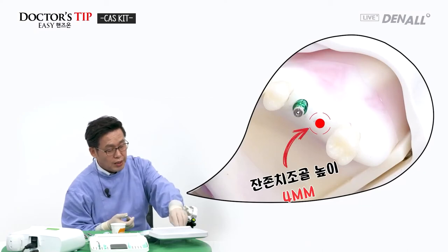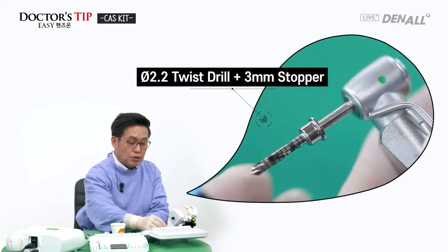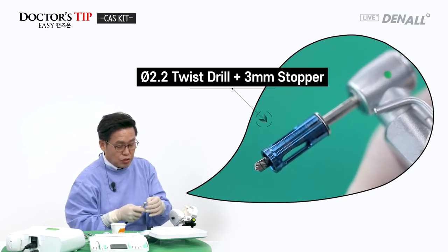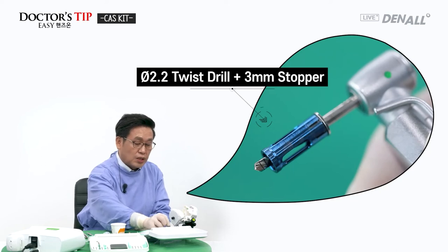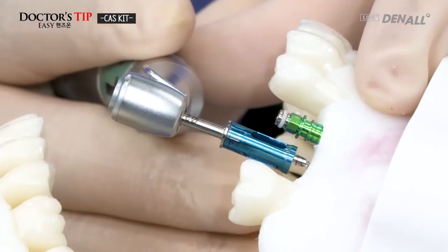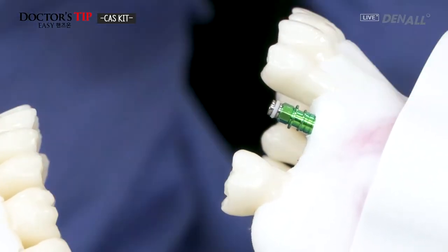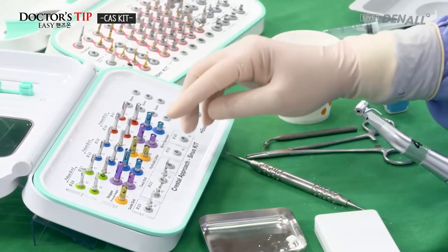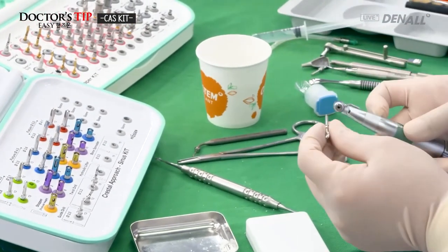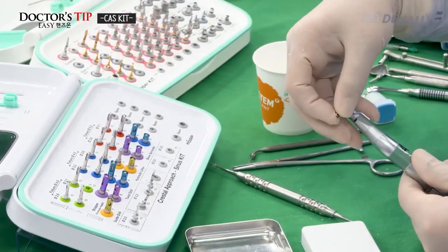At 26, the residual bone height is 4 millimeters. The 2.2 twist drill will use a 3 millimeter stopper, 1 millimeter less than the height of the residual bone. Drill hole is made. Next, the 3.1 diameter CAS drill and a 4 millimeter stopper are connected to advance 1 millimeter.